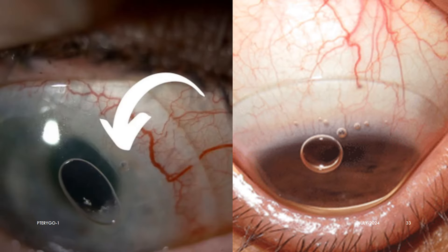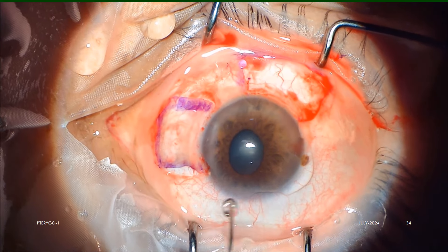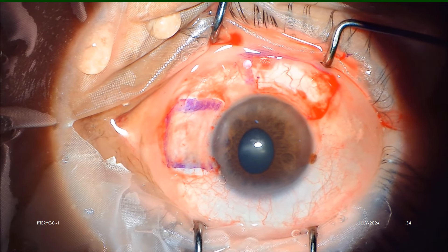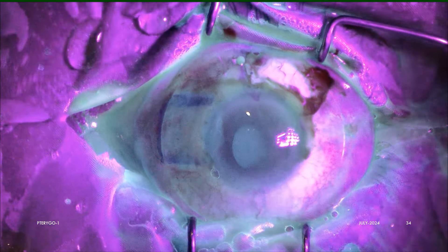At this stage, if some air gets trapped under the lens, please don't worry — air bubbles will get burped out from the 12 o'clock position when the patient sits up. We then put moxifloxacin drops over the BCL. Please notice that the graft margins, if moved, can be nudged even through the BCL. The BCL becomes more visible in UV light because it absorbs and reflects UV rays.